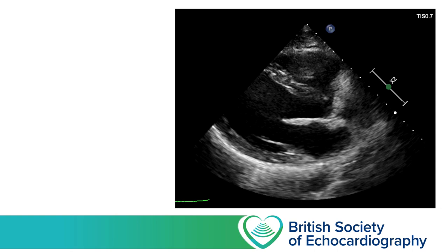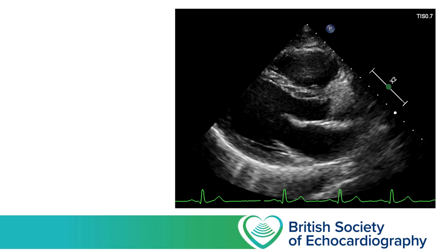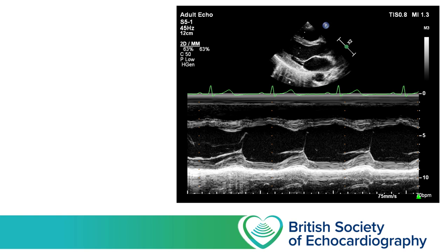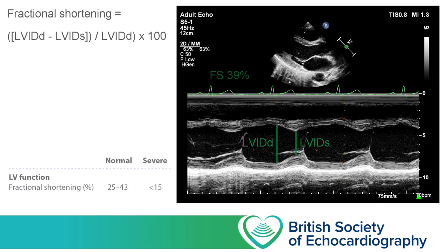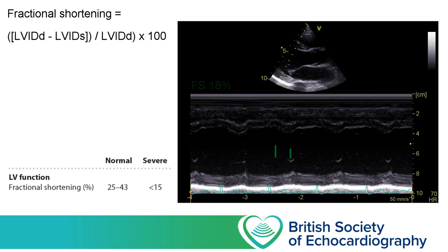We can visually assess the change in cavity size, but if we want to put a number to it we can measure fractional shortening, done either from a 2D video clip or from an M-mode graph taken perpendicular to the LV walls. Measure the LV cavity diameter just beyond the mitral valve tips at end diastole, then advance to peak systole where the cavity is at its narrowest and measure again. The percentage decrease in LV cavity diameter is fractional shortening — we're looking for at least 25% change, with less than 15% suggesting severe LV impairment. In this healthy volunteer, fractional shortening is 39%. By contrast, this M-mode graph from a female patient of similar age with acute septic cardiomyopathy shows fractional shortening of just 18%.